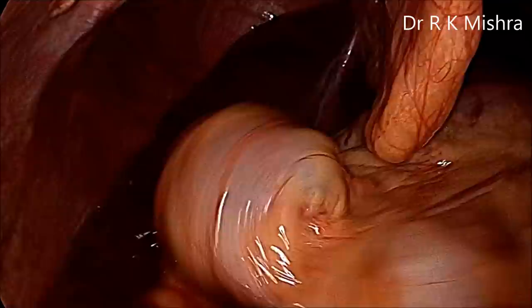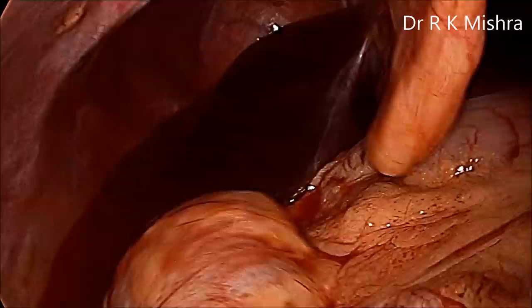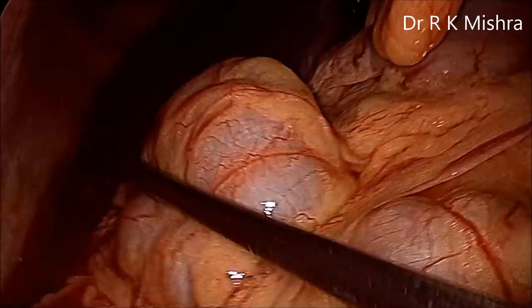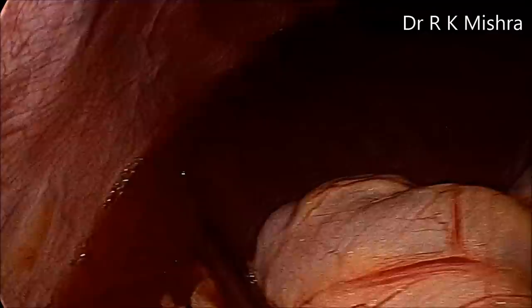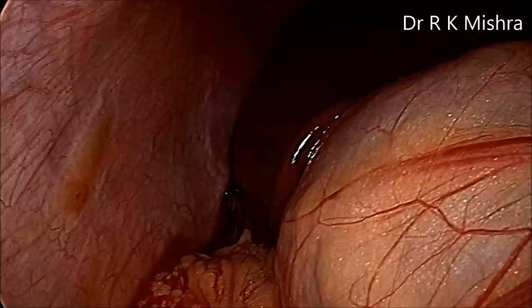After that, irrigation and suction of the upper abdomen is performed. We can see the sub-diaphragmatic area and Morrison's pouch has a lot of blood collected. It is important to do thorough lavage of the splenic fossa and sub-diaphragmatic area because the blood from the rupture is collected all over the abdomen. It should not be ignored; otherwise it can create peritonitis and sub-diaphragmatic abscess. All the blood from all over the abdomen is sucked out and the area is repeatedly cleaned.